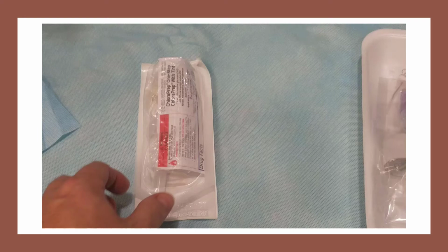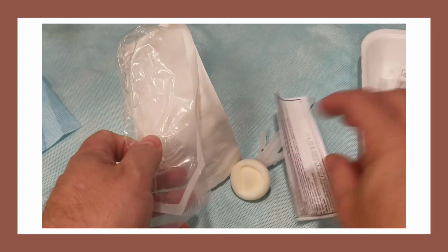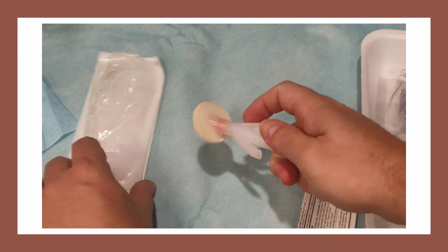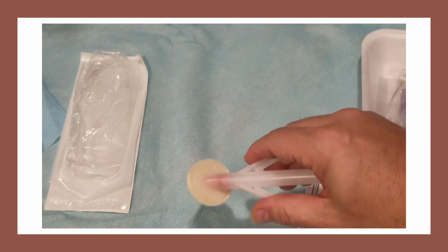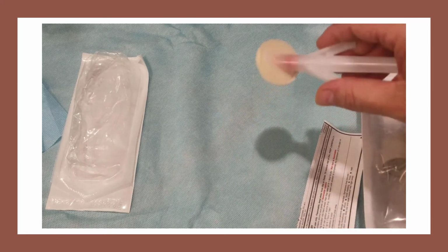This is an example of a chlorhexidine prep. We can see that it looks very similar to the IV kit preps. You're going to pop it, and then you're going to move in a back and forth motion for 30 seconds to get the area nice and clean.